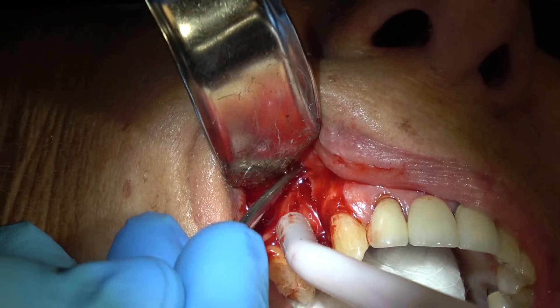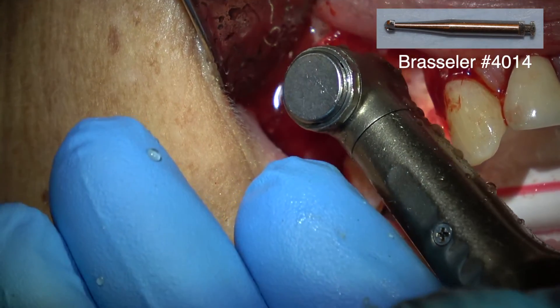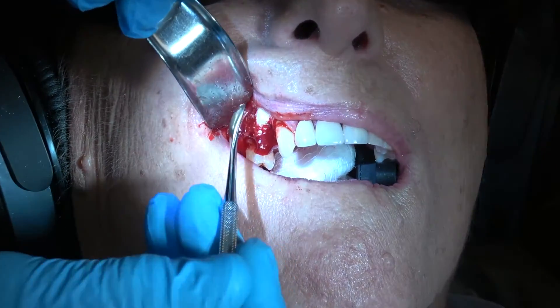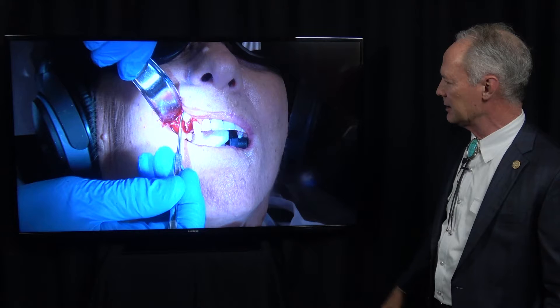You can see this buccal bone was very thin. I'm cutting around the tooth into the trabecular bone — that's where the blood supply comes from. I want to be sure I've got good connection with the source of blood so this will heal nicely.